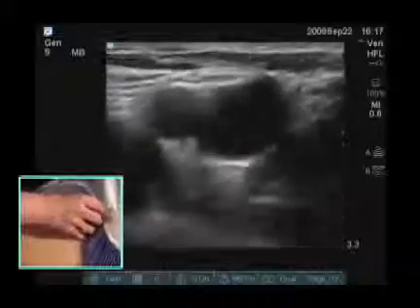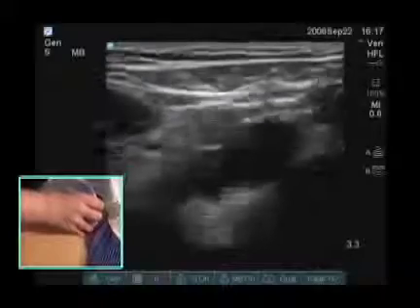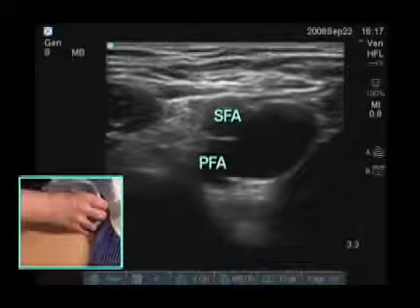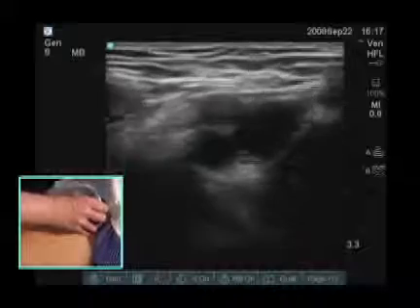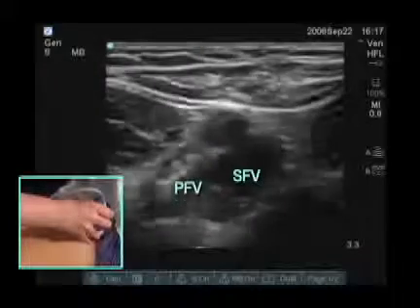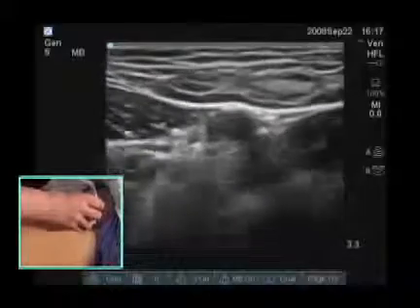We see our common femoral vein and saphenous junction here, and we can continue compressing just a few centimeters below this. On the ultrasound, we've seen the division to superficial femoral artery and profunda artery, just lateral to the vein. And then we should see the vein divide to femoral vein and profunda vein. Again, compressing all the way down until you see this junction.